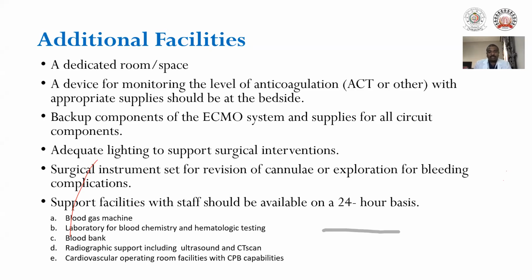Radiographic support, including ultrasound and CT scan, and cardiovascular operating room facilities with CPB capabilities, if there is an emergency need for cannulation or going into full cardiopulmonary bypass.